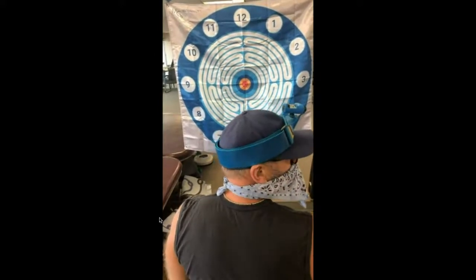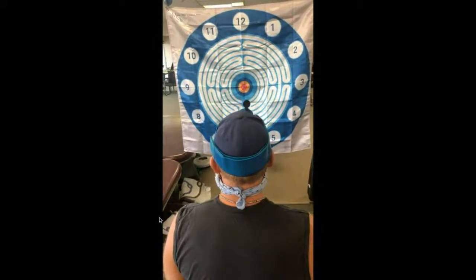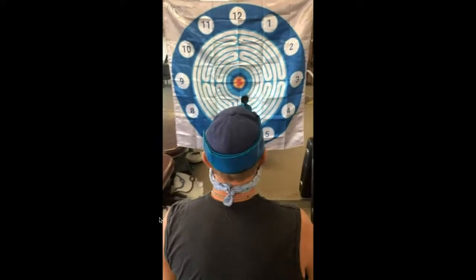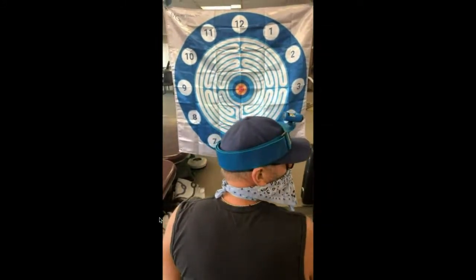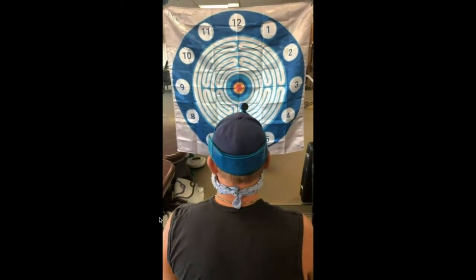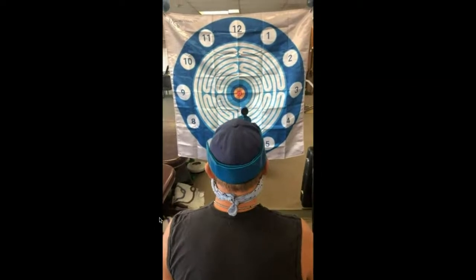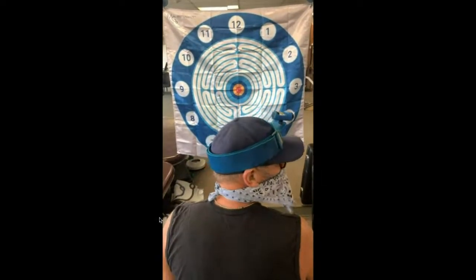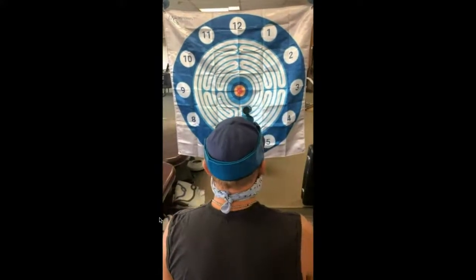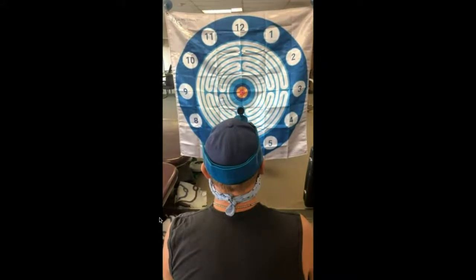But we want them to do 3 practice trials with their eyes open, and then they do a minimum of 6 practice trials with their eyes closed. If 3 out of the 6 of those are outside the light blue field on our target, like you see here with this gentleman, then they're going to have a positive response for joint position sense error at the head neck. If they have 4 trials that are inside the standard deviation, you can see how he's way off, then you might as well stop testing.